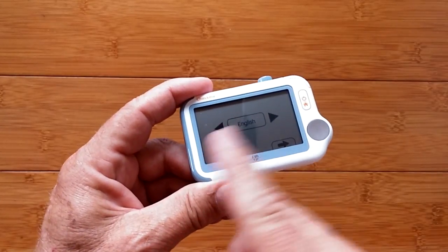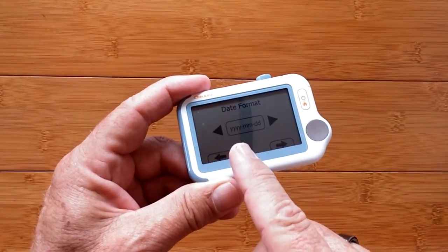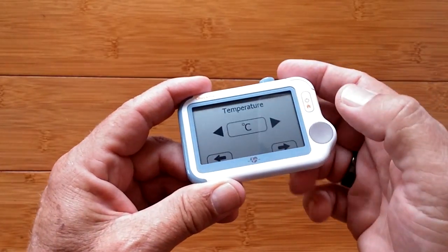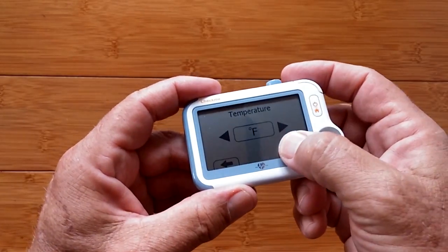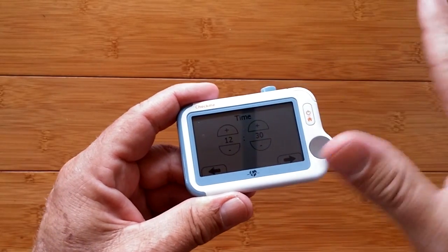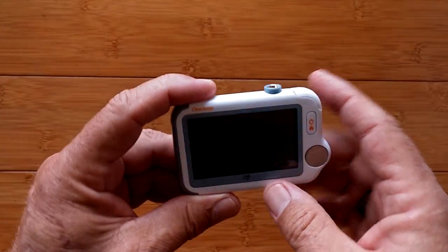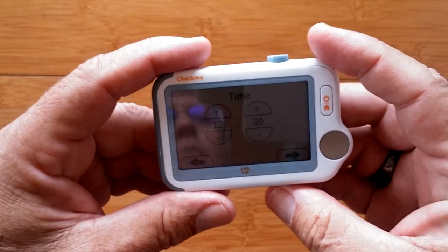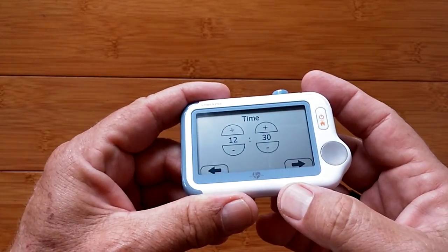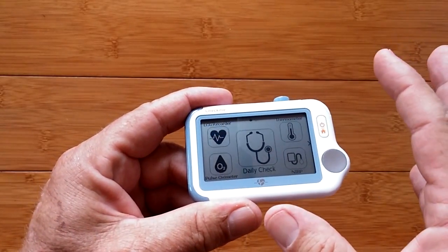The device supports multiple languages. You can set the date format — year, month, day — in any order you like, and choose temperature units. I'm switching it to Fahrenheit. You can also do a factory restore. Note that it has a reflective screen — not backlit — so it can be harder to see at certain angles. You can set the time, and then you're on the main page where everything happens.